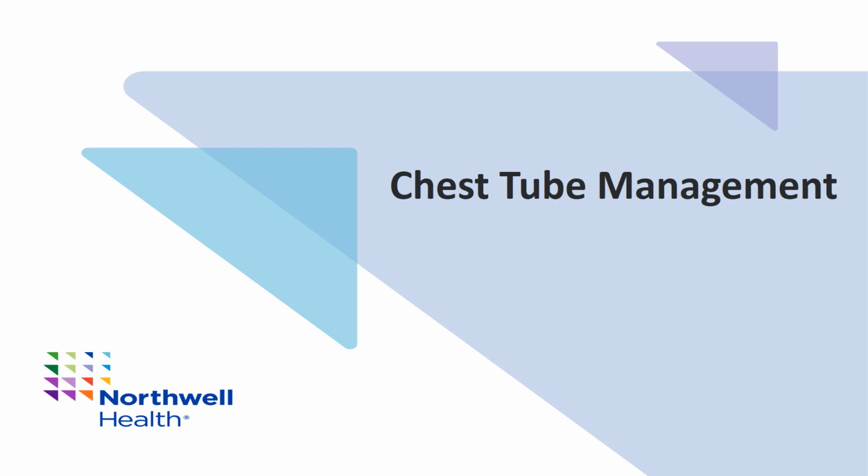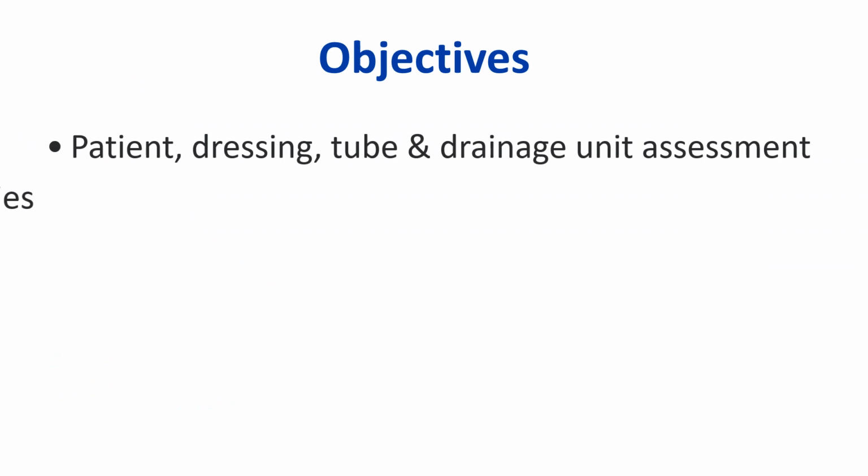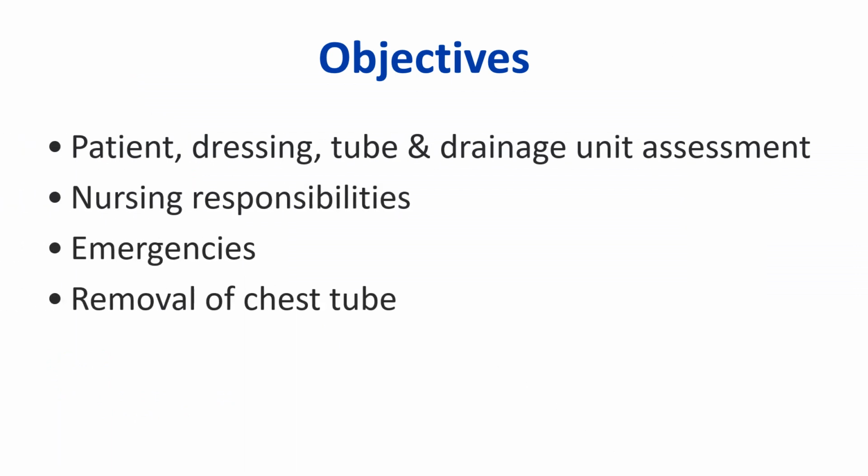Welcome to Chest Tube Management by Northwell Health. In this presentation, we will discuss assessing the patient, dressing, chest tube and drainage unit, the nursing responsibilities of managing a patient with a chest tube, possible emergency scenarios, and the steps of removal of the chest tube.